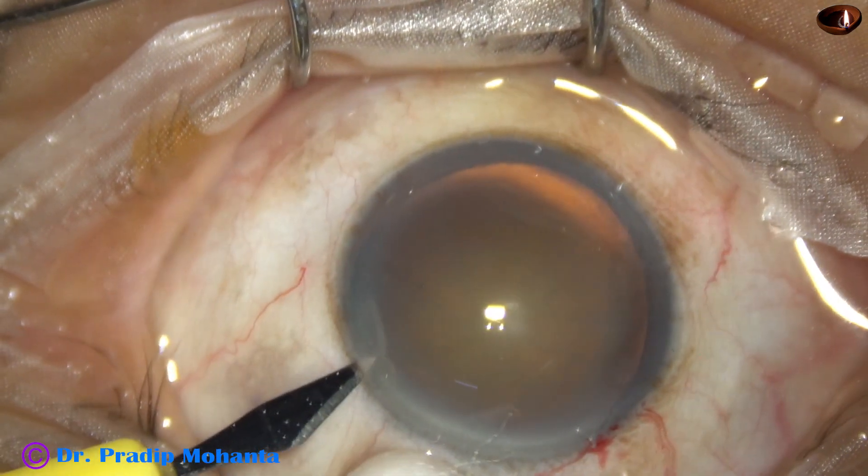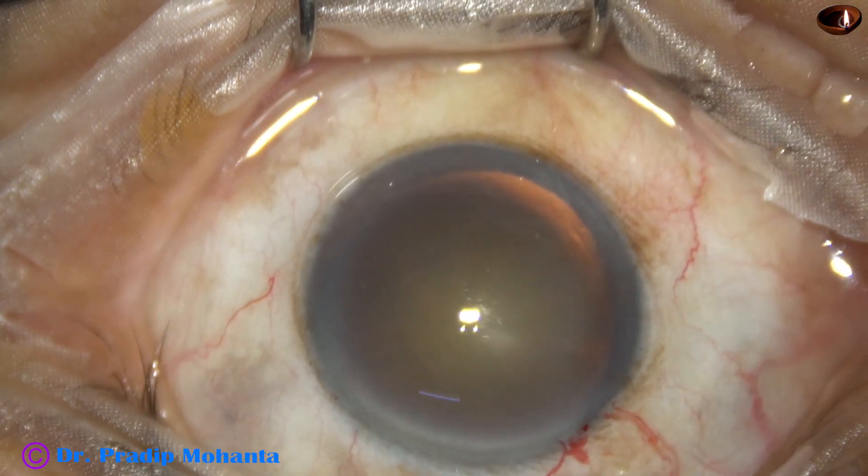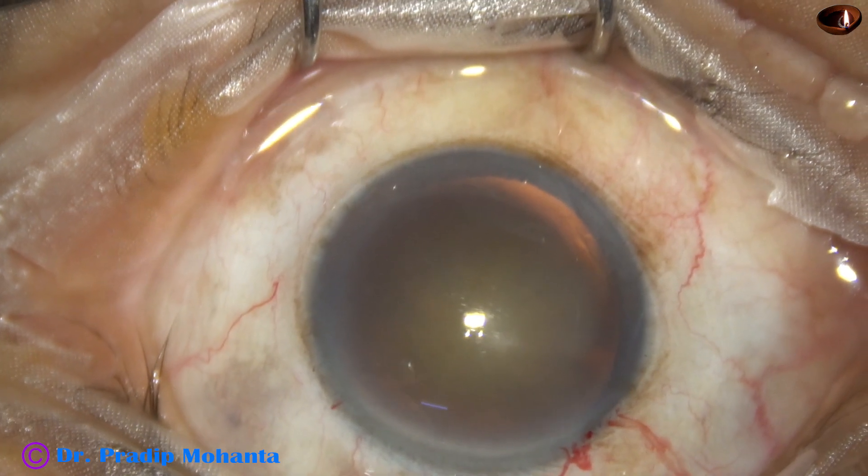This is a side port on the left side of the main incision, about 3 o'clock hours away, and now capsulorhexis is to be done.